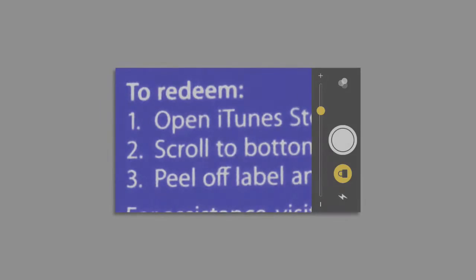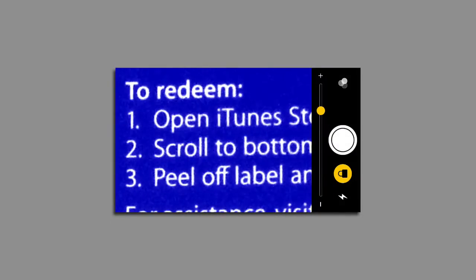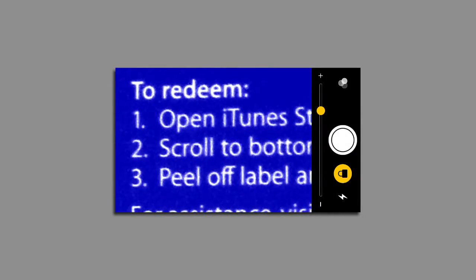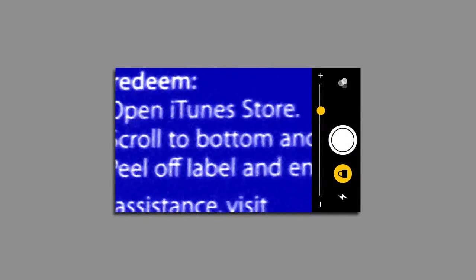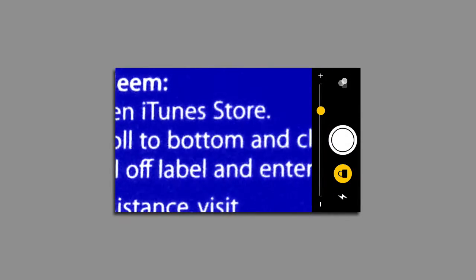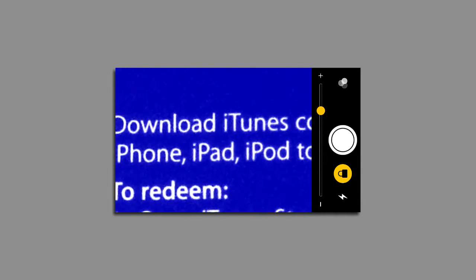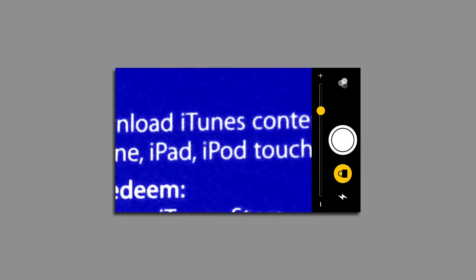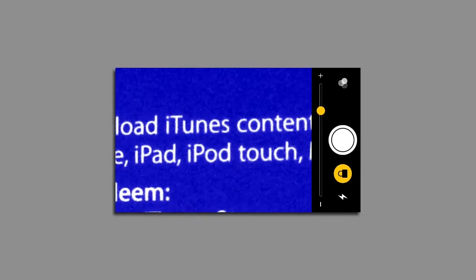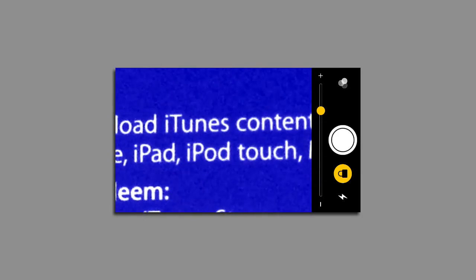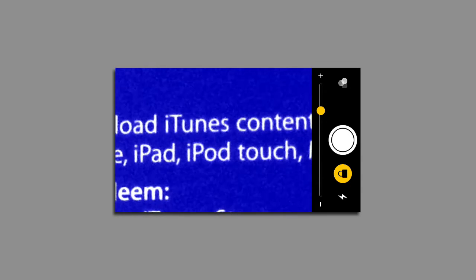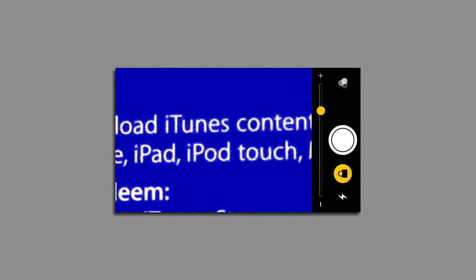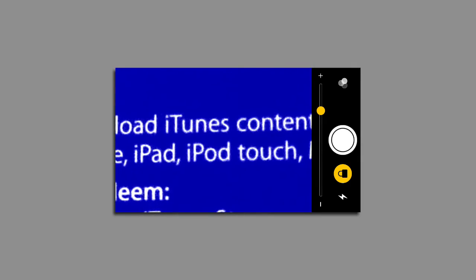So overall the magnifier built into iOS 10 is quite a useful little video magnifier. It's got a good choice of high contrast color modes. The main problem with it is keeping the iPhone still. If you hold it by hand it does tend to tremor quite a bit, so ideally you need some sort of stand to stand the iPhone in.